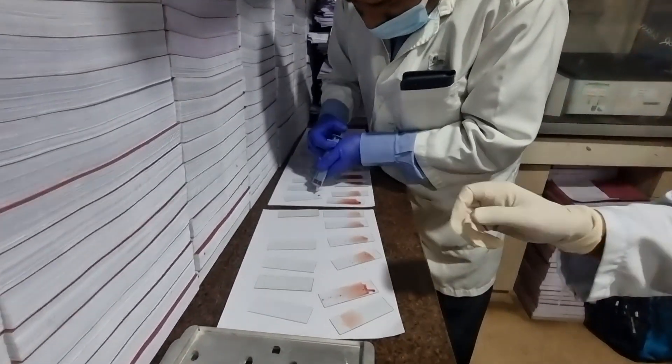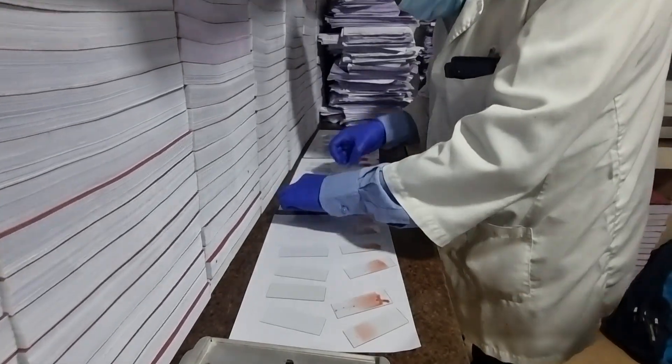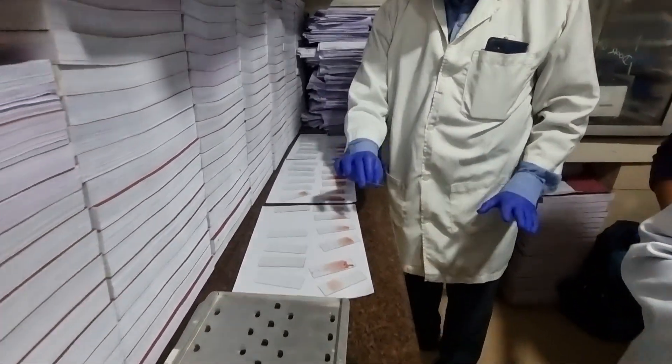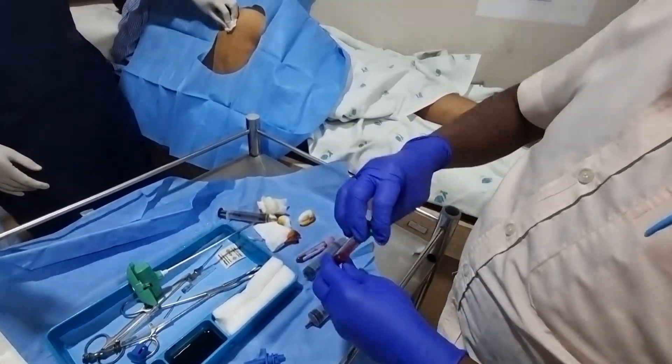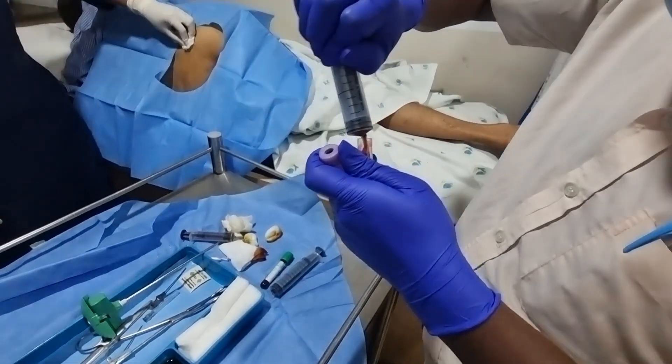This will be fixed in methyl alcohol. After that, we'll stain it with Leishman stain and Giemsa stain. Then the sample is collected in the flow cytometer and also for cytogenetics. So these are the ones which will be collected.